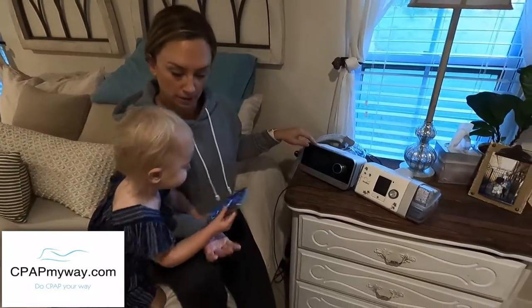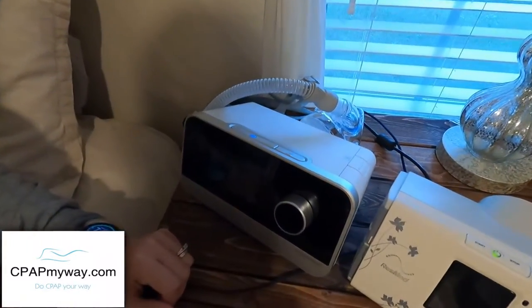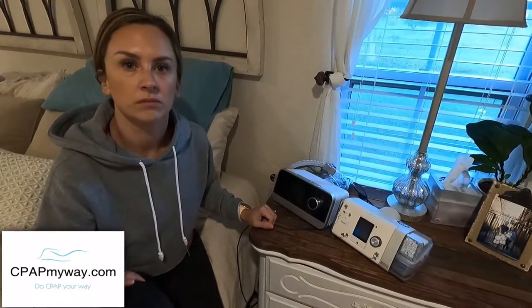Any adjustments that we had to make? So we changed the EPR, which is what they call it on the AirSense 10. We adjusted that down a little bit. On the AirSense 10 it's a 3 for me, and I went to 1. What's it called for the iBreeze? Exhalation relief. IPR is what they call it for this particular unit, and it was perfect. So this one was a little bit more aggressive on the exhalation relief overall, and you had to reduce it. Yes, on the iBreeze. Then we were good to go. Didn't wake up once. Didn't adjust it once. Good job. Two thumbs up.